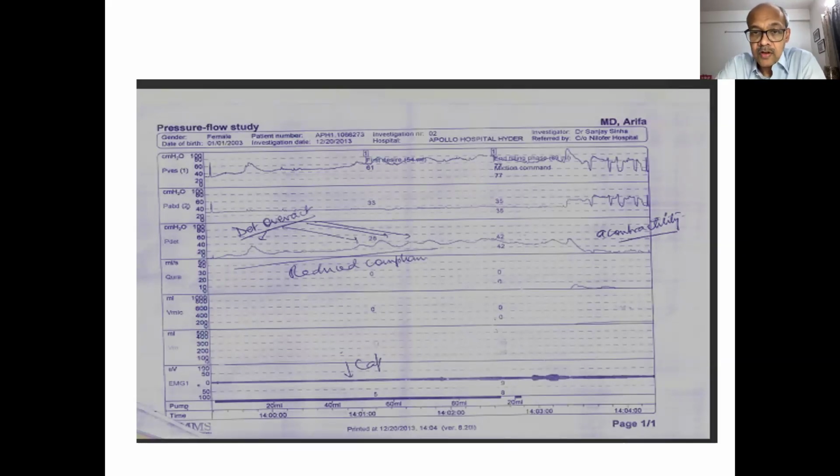So let's say if on an MCUG, which you can combine with this to get most of the information, there's a large diverticulum, or if there is large volume reflux on one side, then these pressures, which are already bad, would in fact be much worse because you would be underestimating those pressures.